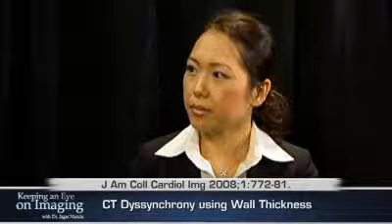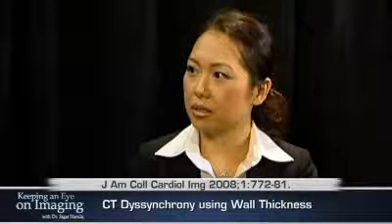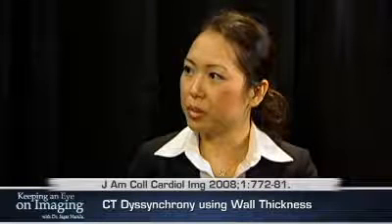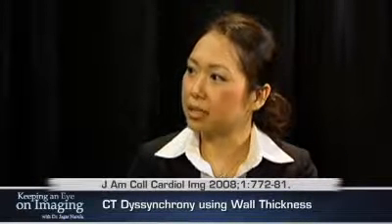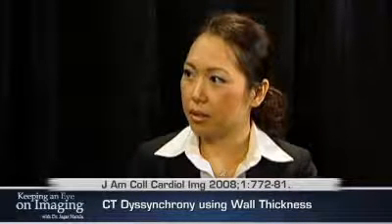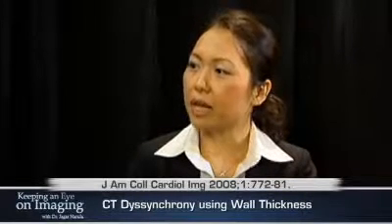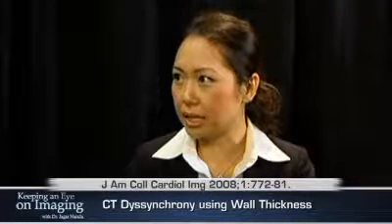So let's speak a little bit more about this DI, this measure that you developed. What specifically did you look at? You divided the left ventricle into various segments, and then what was your measure? What did you actually measure? Yes, so each of the short axis images were subdivided into 6 standardized segments. From that, we would do a standard deviation of the time to maximum wall thickness. So you measured the time from the R peak, if I remember correctly, to the maximum wall thickness. Correct. And so we'd take the standard deviation per slice, and then we would average the standard deviation of all the slices to get our dyssynchrony index.